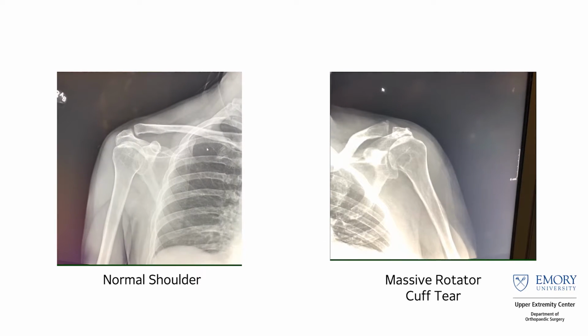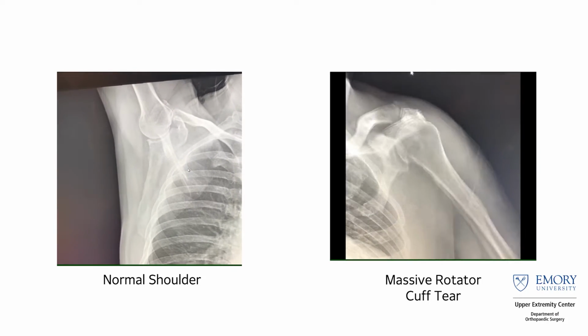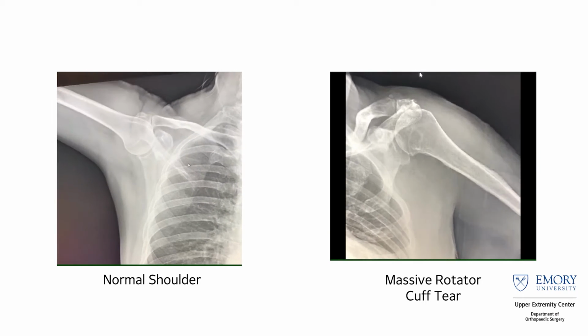I showed you that massive cuff tear. I think it's cool to see how the head shifts up, as we all assumed it did in these patients that have rotator cuff arthropathy.